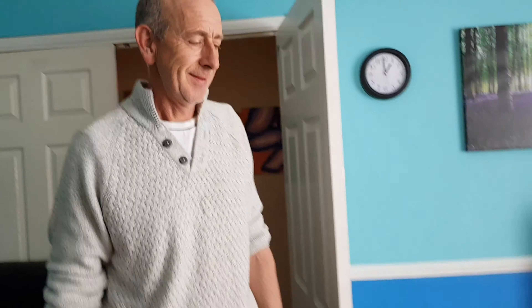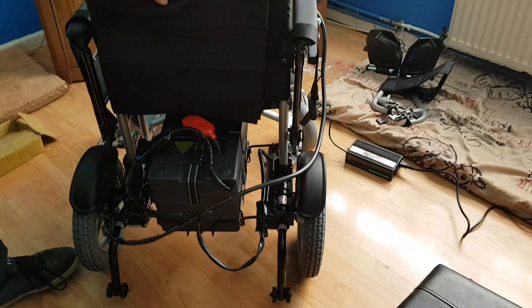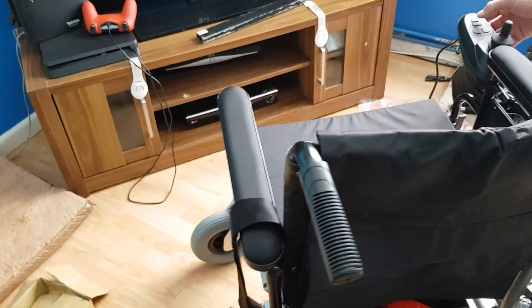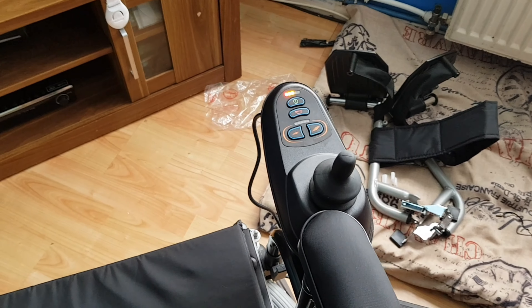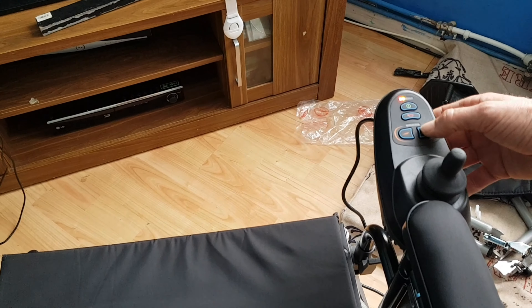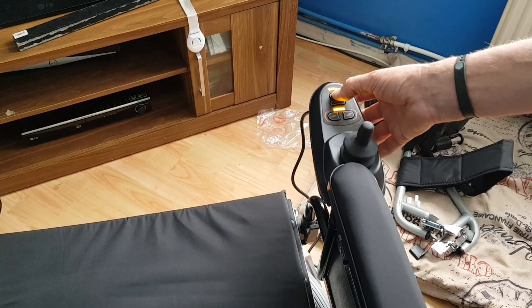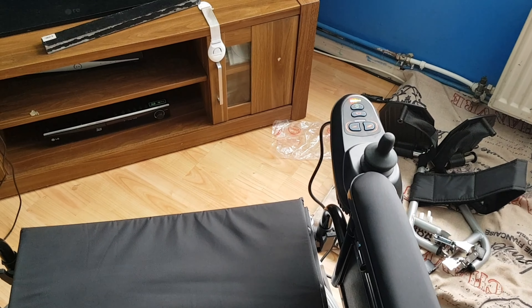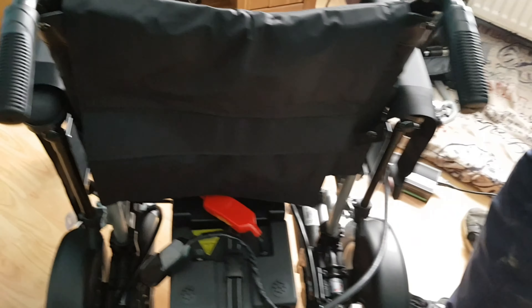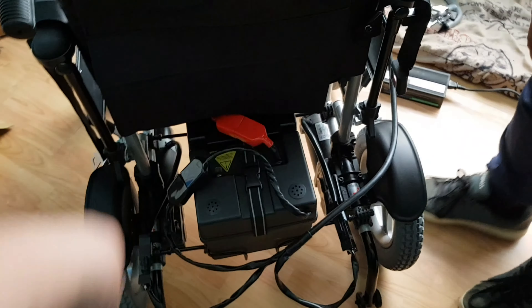Here's my dad — say hi. Hi. I was explaining how I was being stupid about the charger. Because I thought you would have had to take it off, put it over there, let it charge, and then put it onto the thing. It's got a horn — that's so cool. I think that's to change the speed. I wouldn't expect it to work just yet, Dad. It does have a bit with the flashy lights in the manual, but I have no idea what that means. Do you reckon that's supposed to get tucked away so it doesn't get caught on anything?